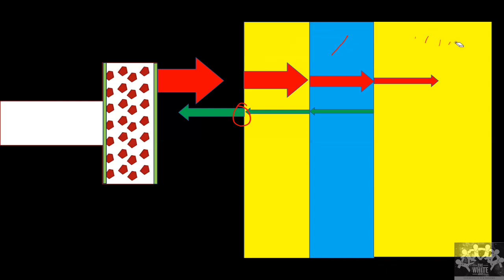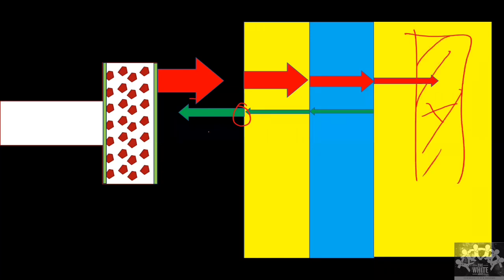If I keep going deeper and deeper, we will lose the complete energy and we will not get any reflection, so it will appear completely black. Whichever structure sends back reflected sound appears whiter.